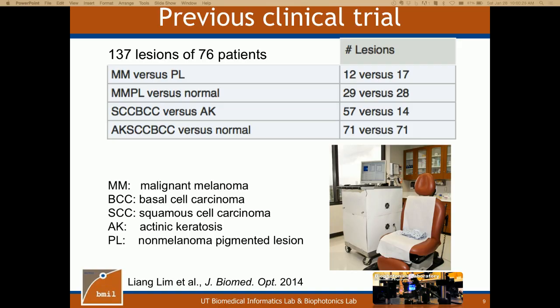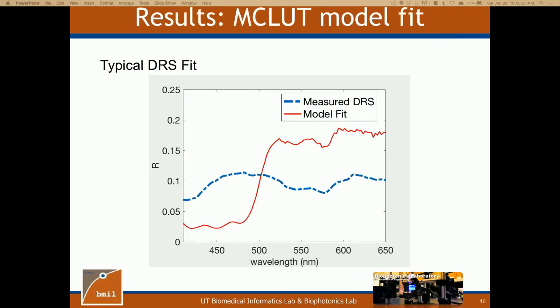To answer this need, I use my Monte Carlo lookup table model to fit the measured reflectance in our clinical database.